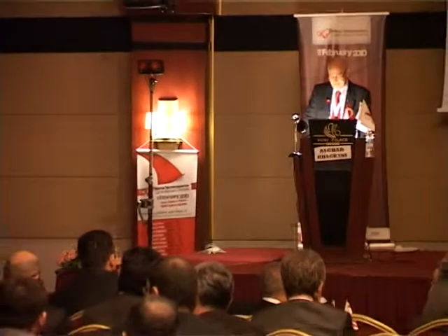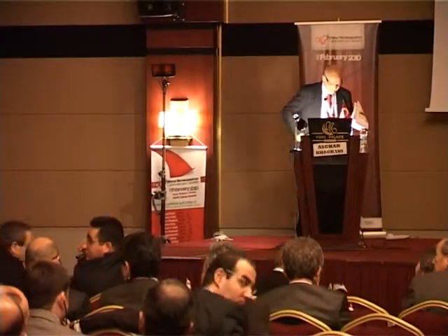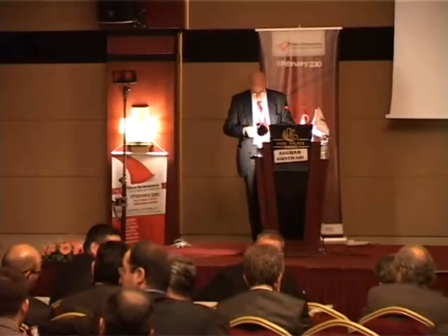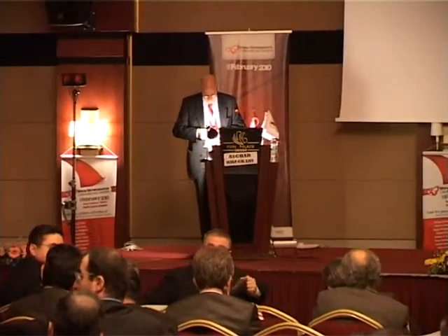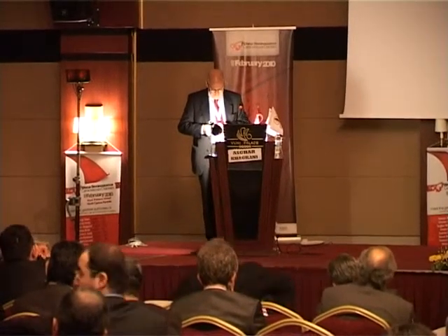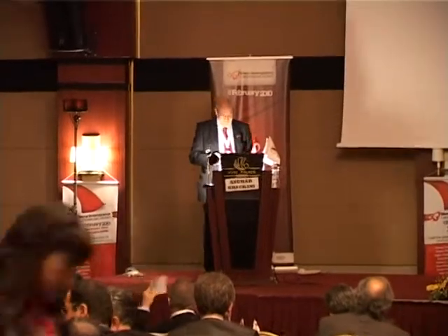Just as a comment, on the right side, as Professor Khaghani said, it's all about managing the right, because you're only supporting the left, and if you're supplying a good return back, you can support the left. But many studies don't really show any good predictors, but crudely, if the right is distended and not moving, then usually it will be in trouble. If it's just distended, it doesn't necessarily matter, because as you decompress the left, you shift the geometry by moving the septum, often it offloads it and improves the right.